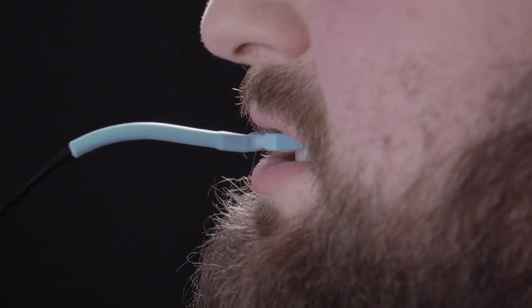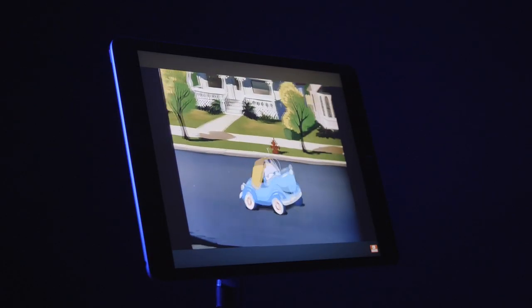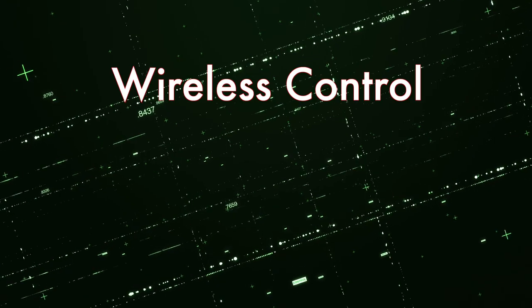Place the switch into your mouth and activate it with a light byte. A soft, tactile click lets you know when the switch has been pressed or released. Send nearly any command with a gentle byte.